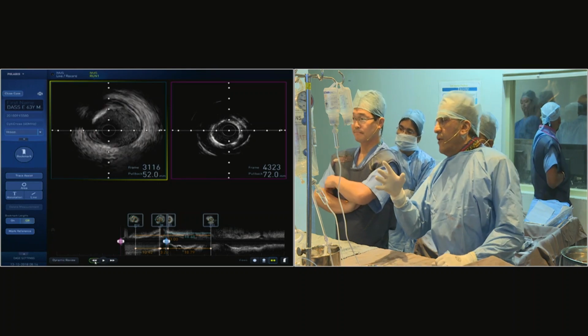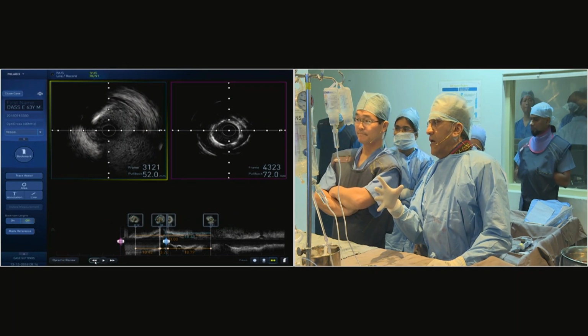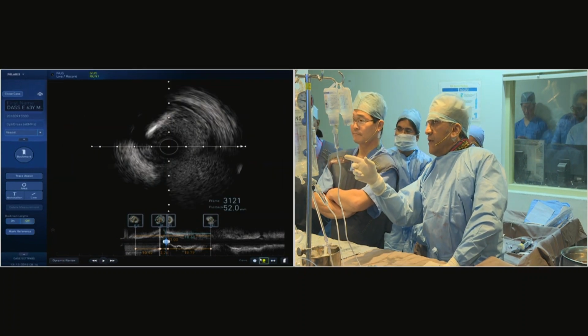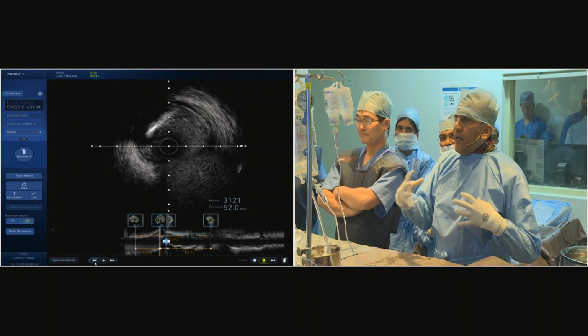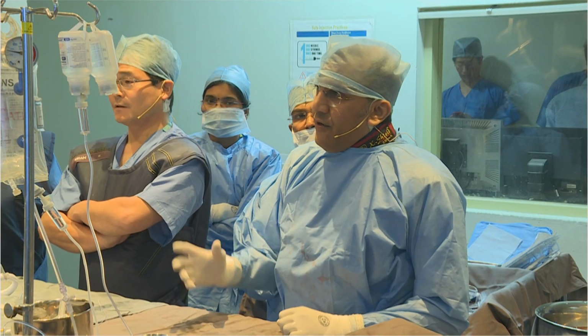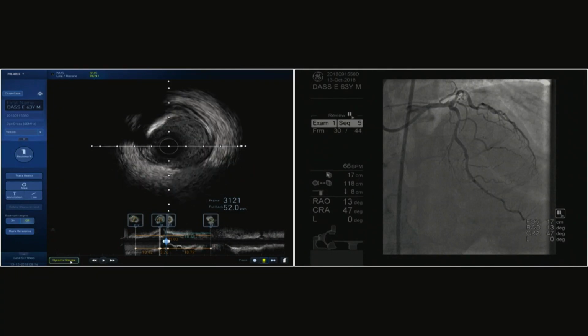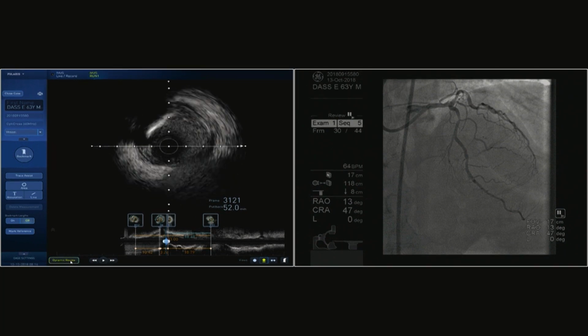Yes. Nikhil made a point that I should put the imaging catheter in the circumflex artery. Now I want to show you the circumflex. We saw the origin, the circumflex ostium. My impression, and I could be wrong here, is that most of the plaque is away from the carina and on the other side, like it is in most cases. I would be happy to maybe place a wire, but I think I would leave the circumflex alone and not touch it. And if required, once we put a stent, we can do an FFR on the circumflex to see if we've done something.